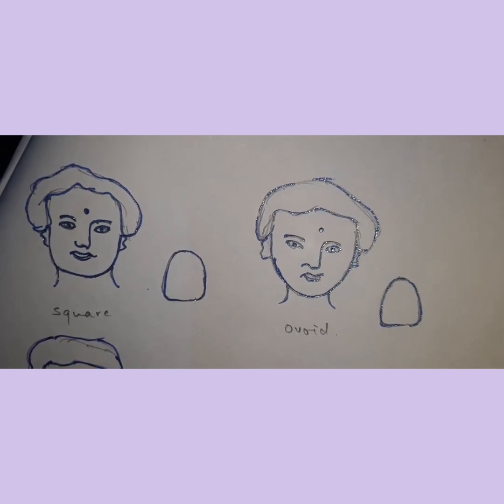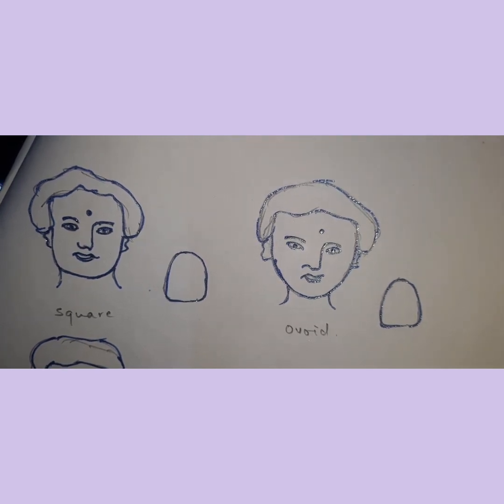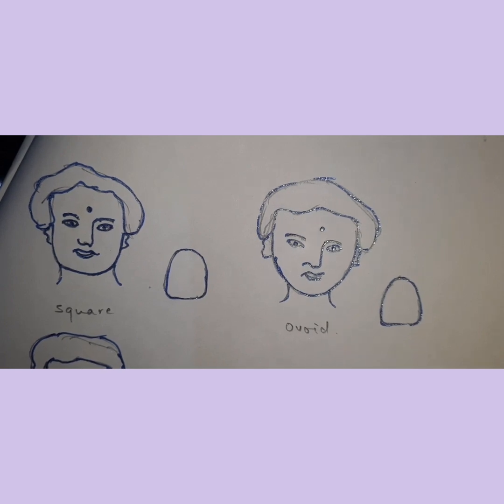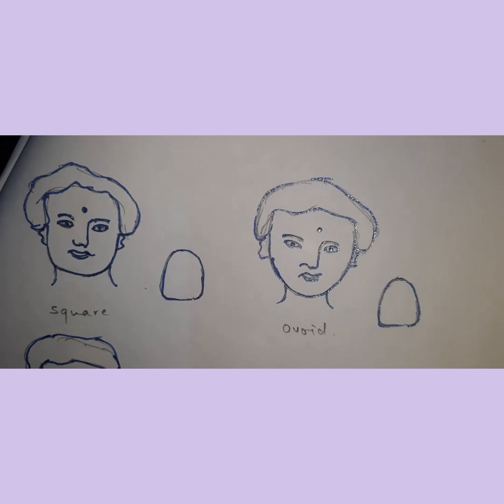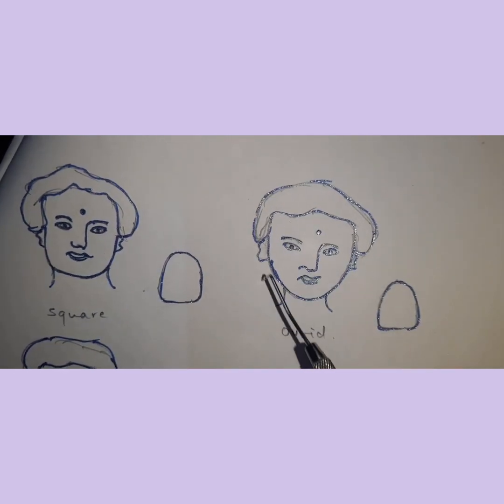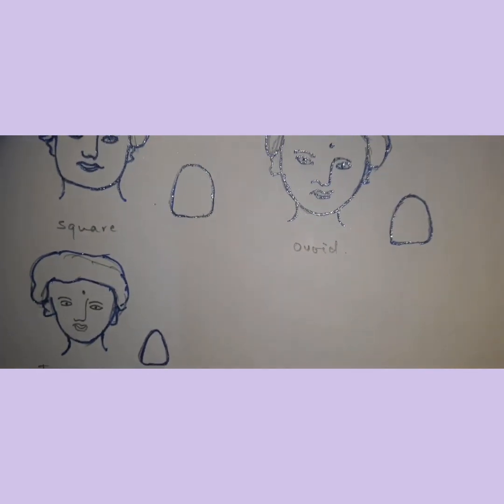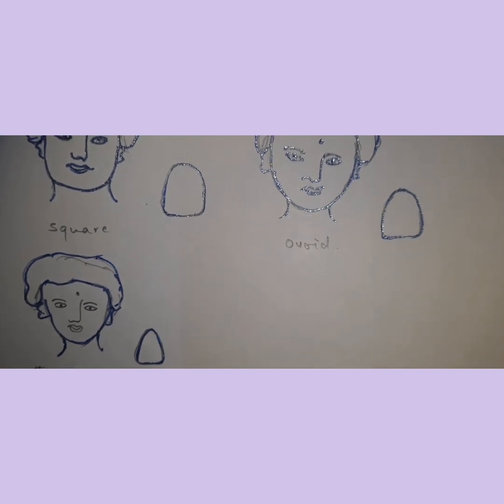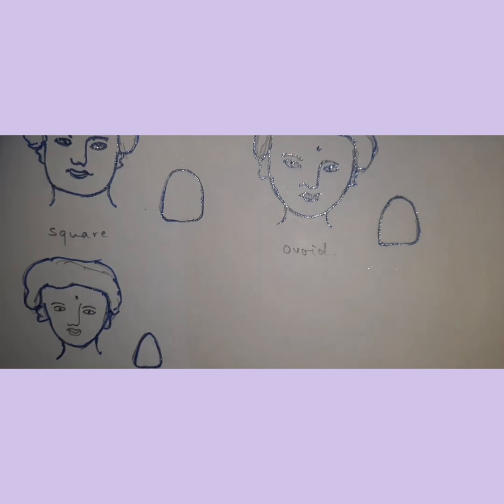Later this was modified by House and Loop, and they gave 3, that was square, tapering and ovoid, which had 5 possible combinations. So you have the facial form which is more squarish, here you have the more ovoid facial form, and this would be more of a tapering facial form. That will determine the form, the shape of the teeth.